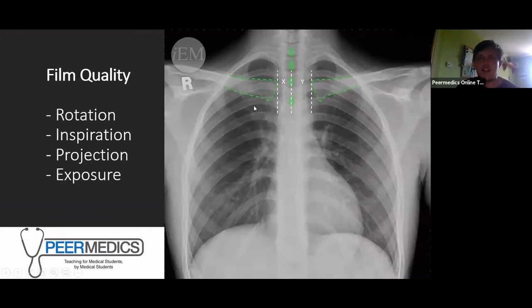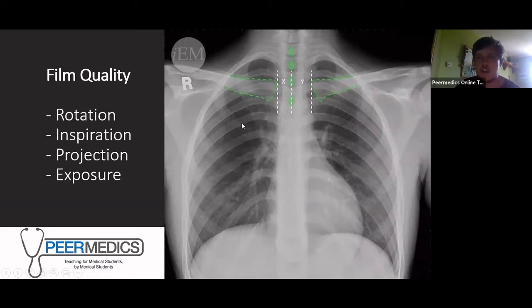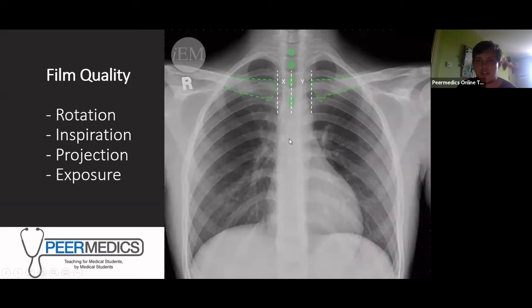To check rotation, look at the clavicles — they need to be equidistant from the spinous process. On this image, the distances indicated by X are a little shorter than those indicated by Y, so you could argue this film is slightly rotated. If you want to show off, also note that the spinous processes should be vertically orientated, following a straight line with no curvature.